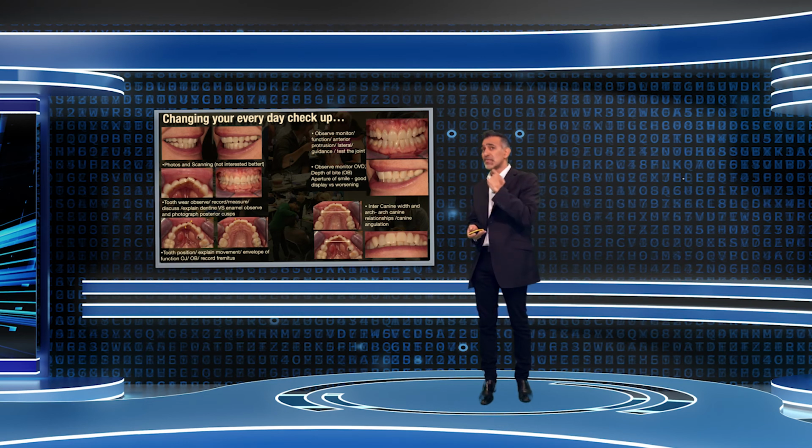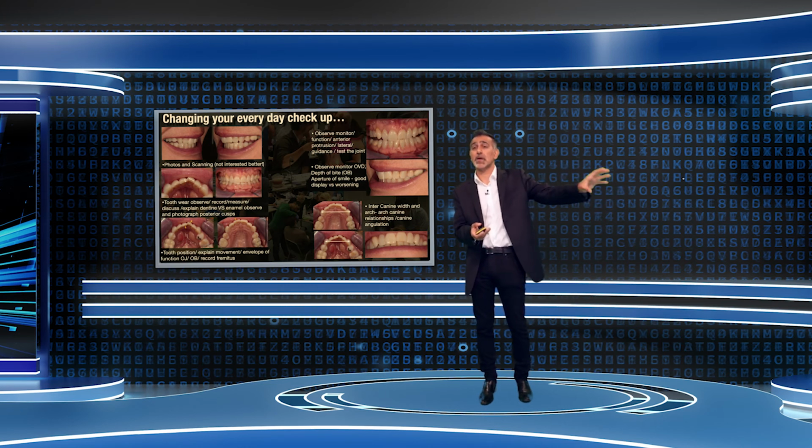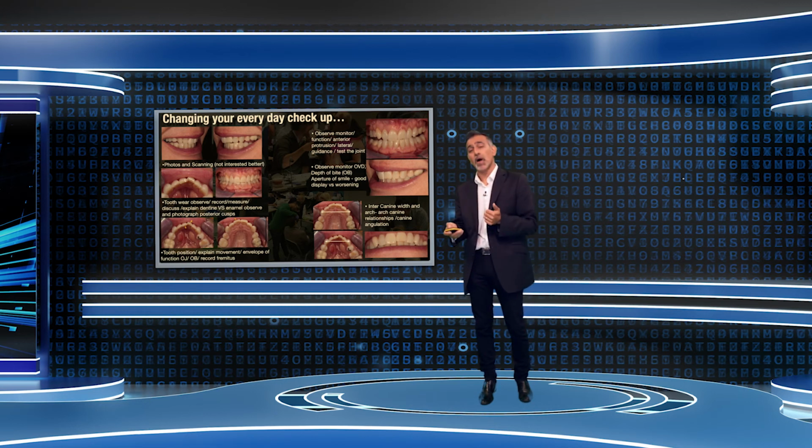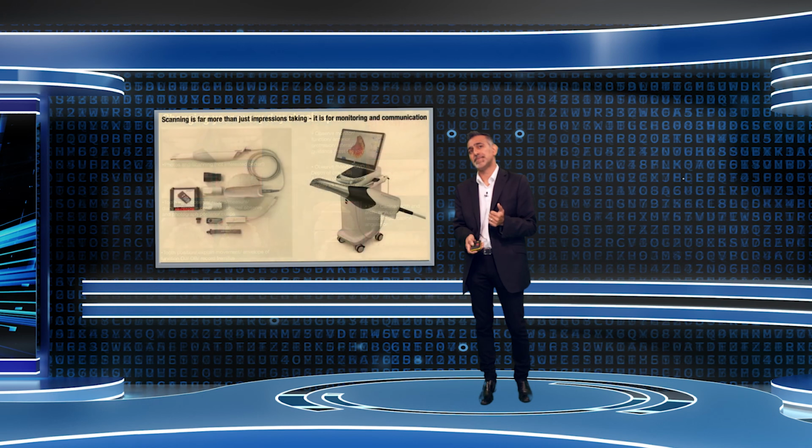Looking at the OVD is also super important at checkups as well. The aperture, the smile, the amount of tooth display, patients can really connect with that, and they can see the difference between what they look like 15, 20 years ago to what they look like now. And also looking at canine width, and measuring canine width. Again, much easier to do with scans. And if you look at patients over time, you will notice canine width starts to collapse, and what effect that can have on the crowding and the guidance through those patients' lifetimes.